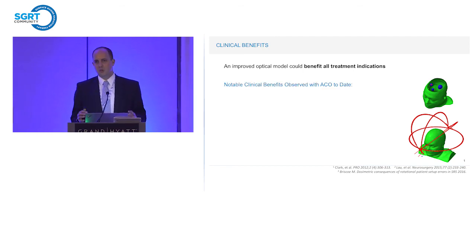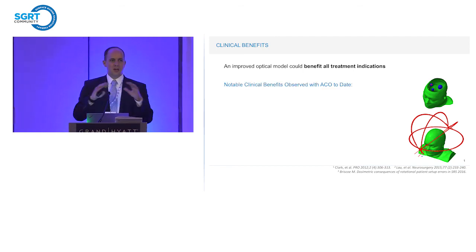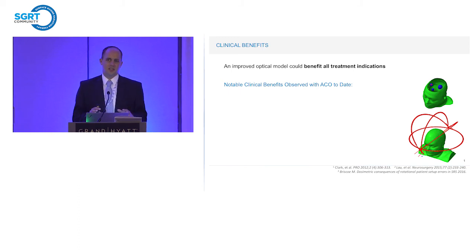The better the optical model we have from our cameras, the more accurate or more robust the surface is that we're creating. So if you're doing a matching algorithm with a very robust, stable surface, the chances are you're going to have much more stable real-time delta values. There's going to be less fluctuations. So I think that's a benefit.